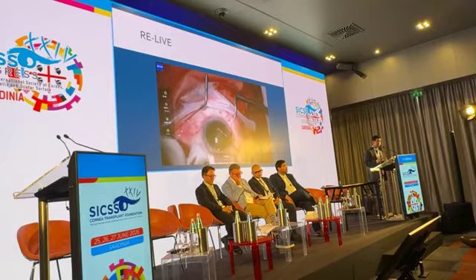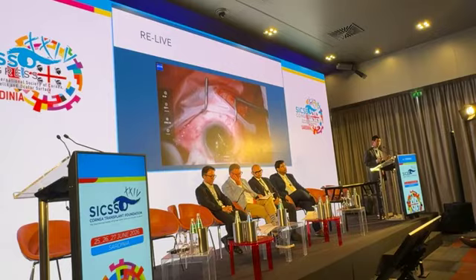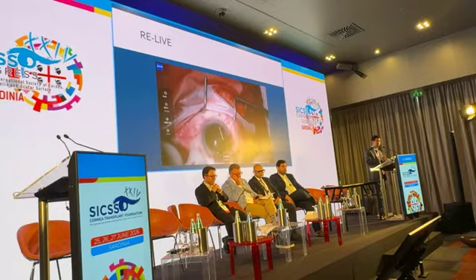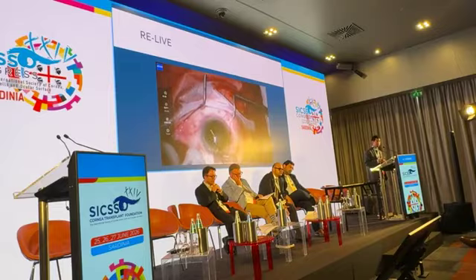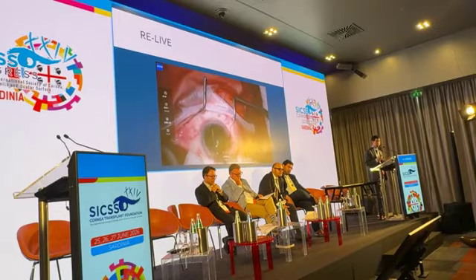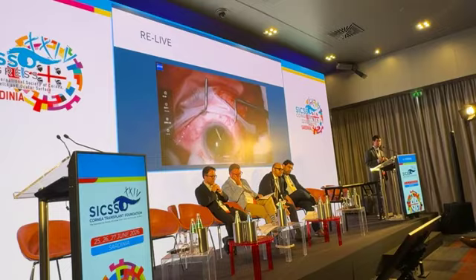And so I like to keep a wet cell at the edge of the graft, so as I move out and squeegee that interface fluid, I'm collecting the fluid. Once I'm getting most of it out and the graft's not moving, then I'll actually try and get the last of these wrinkles out.